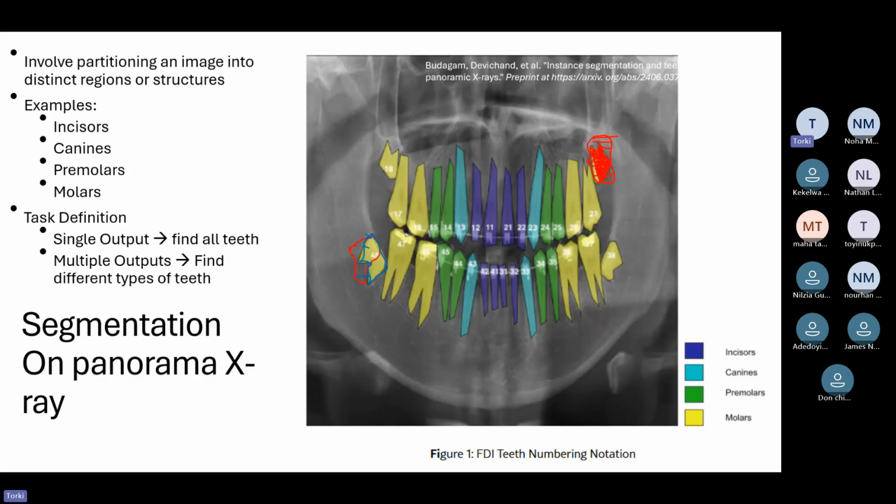You know what I mean? For example, if you would like to detect 4 instances in an image, 4 instances give you maybe 200 pixels, and you have more than 1 million pixels. So if you are computing the accuracy, if you miss the 200 pixels, you still get like 90% accuracy. So it's not making any sense.